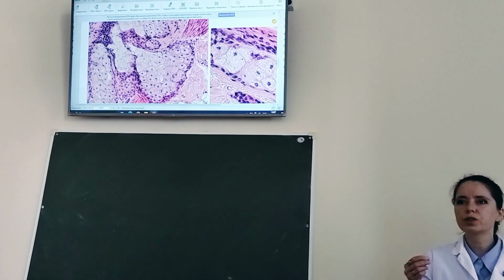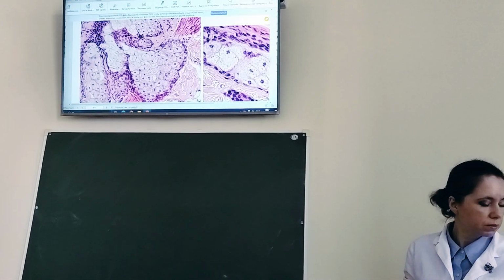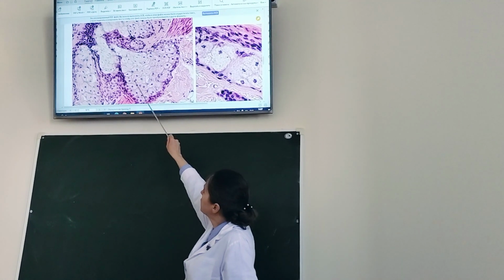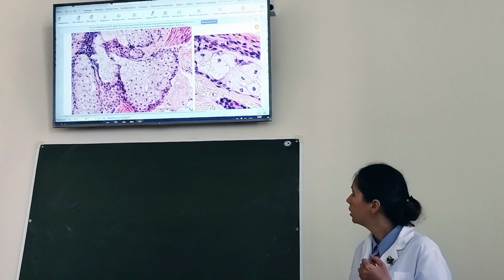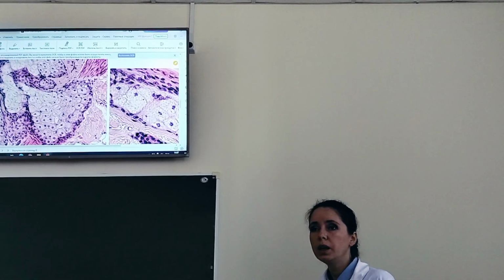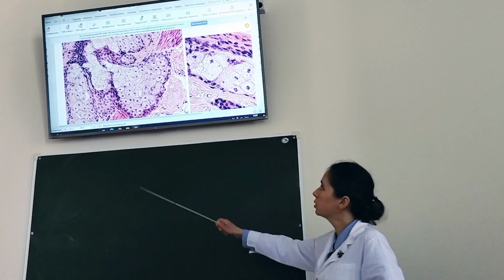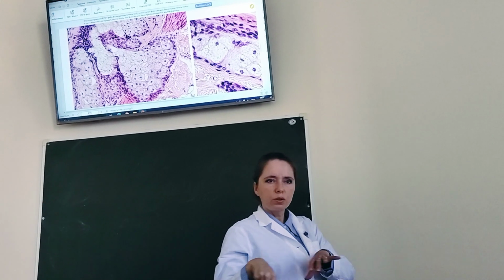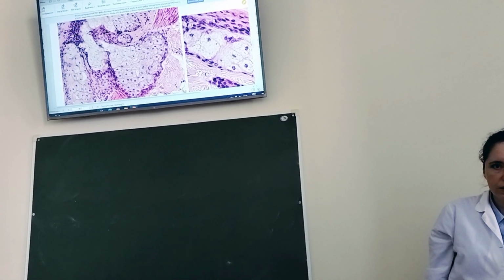And in high magnification, it would be perfect if you say the major differentiated cell type is a sebocyte, a large rounded glandular cell which accumulates lipid droplets. These droplets fill the whole cytoplasm, and upon terminal differentiation, closer to the duct, the cells totally disintegrate. That is all for the sebaceous gland.